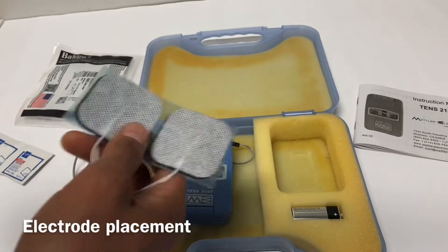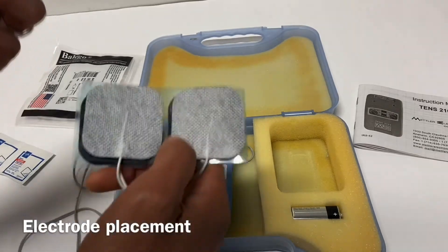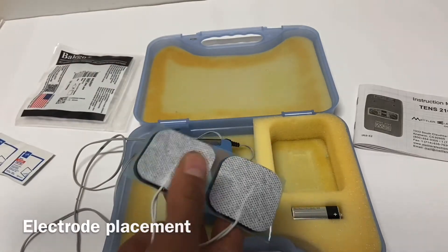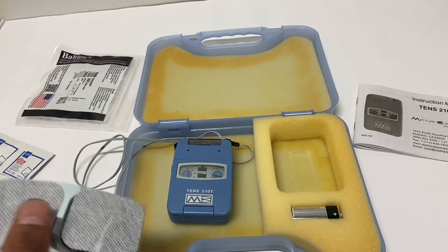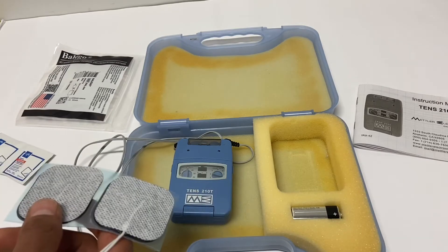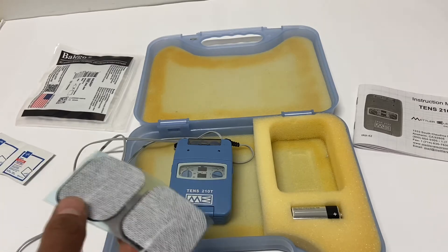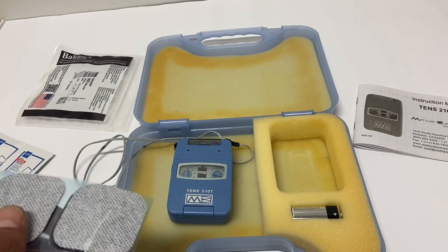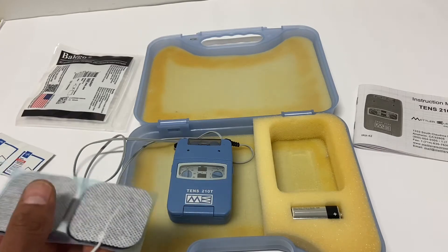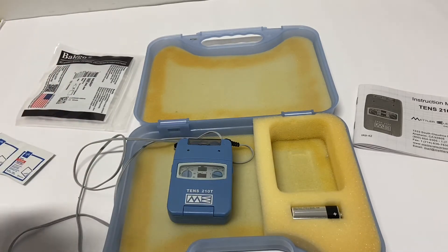Electrode placement is up to you as the clinician based on the goal and the structure you're targeting. With TENS, you can either put the electrodes directly on the painful spot or go around and surround it. Everyone responds differently, so pre- and post-test symptoms to see what works best. It may take a couple of sessions to figure out optimal placement, and it might shift slightly each session. There's no standard protocol — literature may suggest ideal placements but every patient is different.